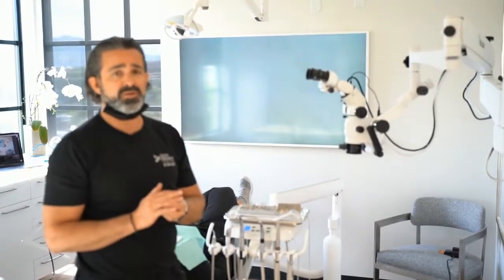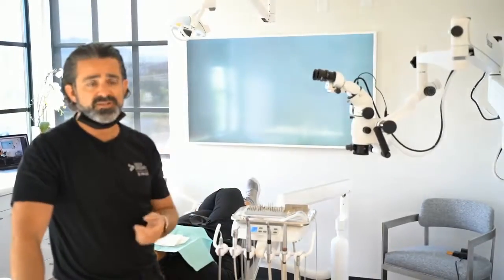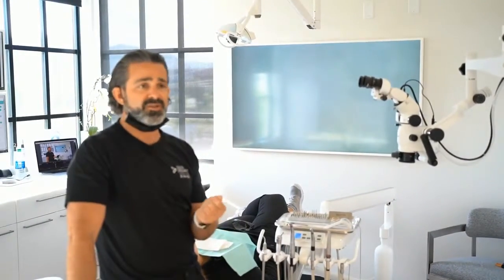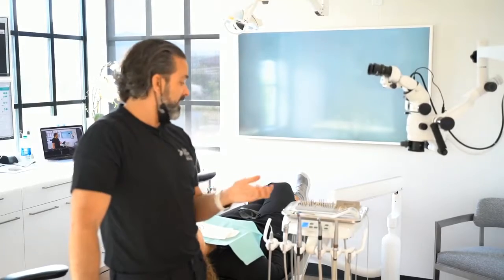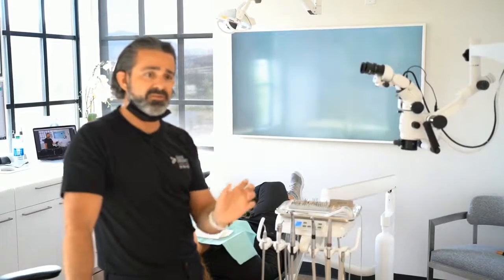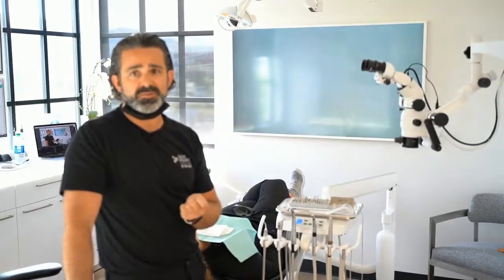Mirrors are also really important. I commented earlier that I do a lot with indirect. And so having a mirror that's not scratched, that hasn't been put through sterilization 101 times, or going to a rhodium mirror, something that's very bright, you'll find yourself having special mirrors for the microscope or even for photography under the microscope. I use different mirror sizes. That also helps with positioning around distal lingual line angles, things like that. But I think that's true probably with loupe dentistry as well.